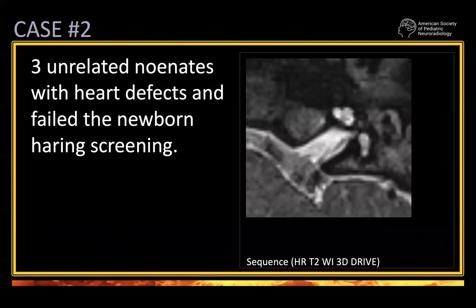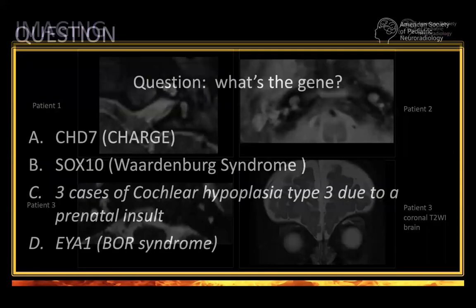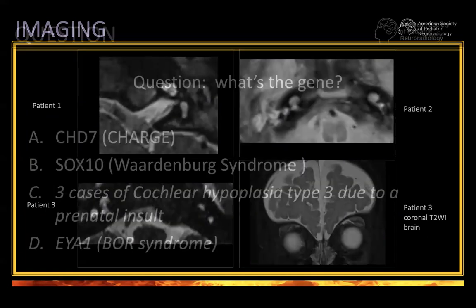Case two is actually three cases — very similar. Three unrelated neonates with heart defect and failed newborn hearing screening. I will show you just one screenshot. Look at the cochlea here — that's enough to do the diagnosis. Also shown is a quite anterior coronal T2 of patient three. Look at the appearance of the ears in these three patients. There is something missing, something wrong in all three patients.